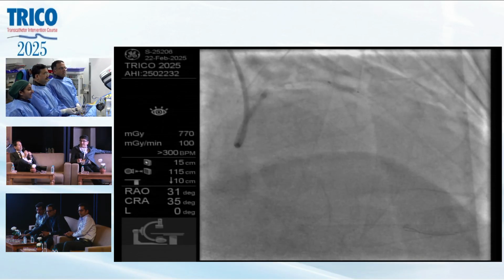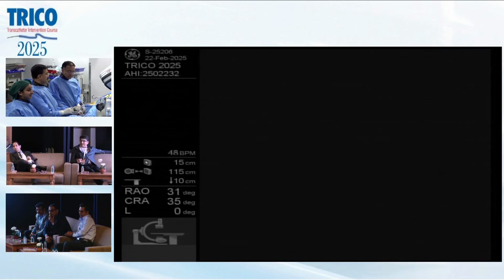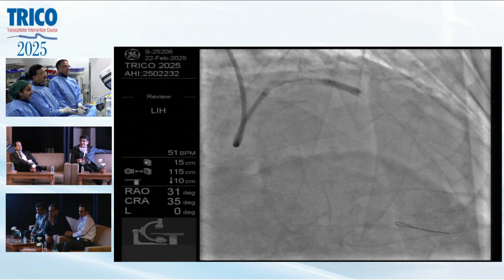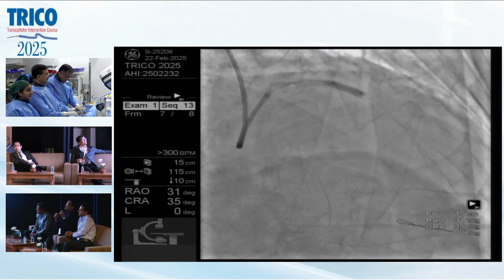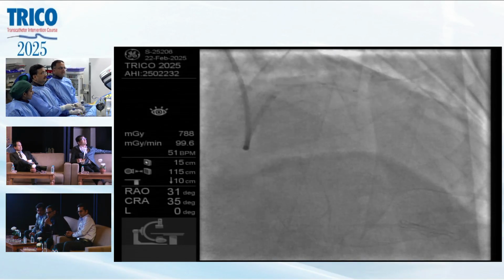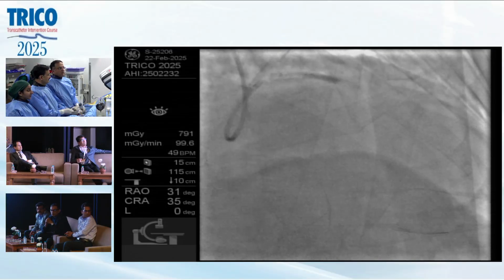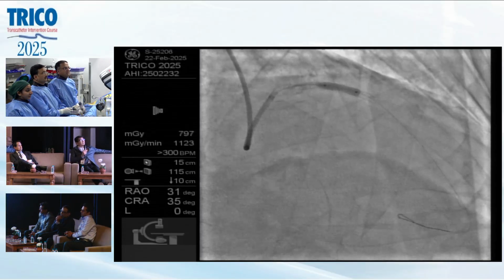Samir, about the classification, I think the OCT classification was given by our Japanese friends. The basic classification was homogeneous, heterogeneous, and layered, right?